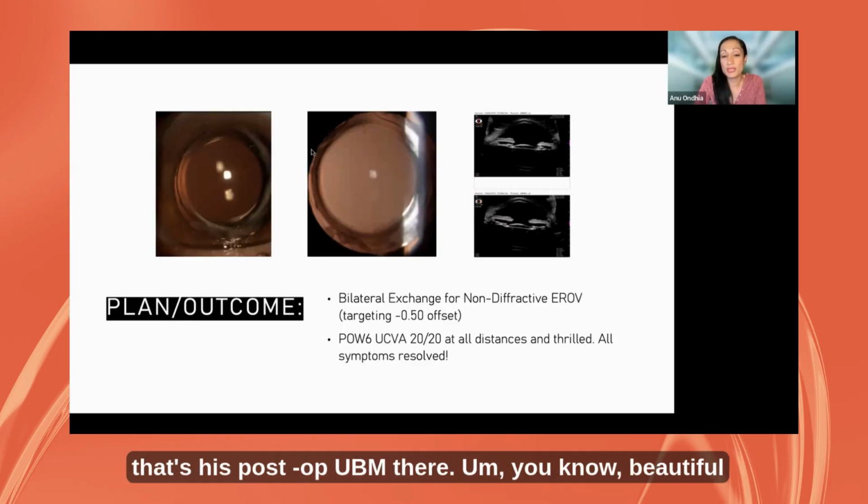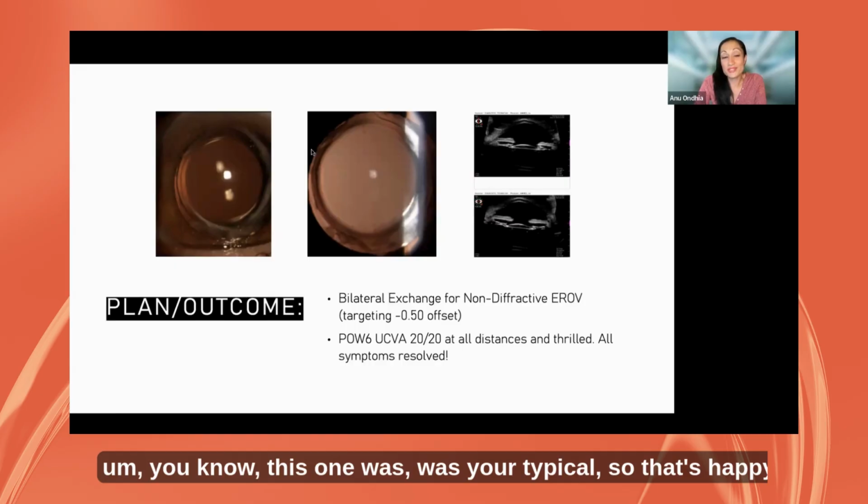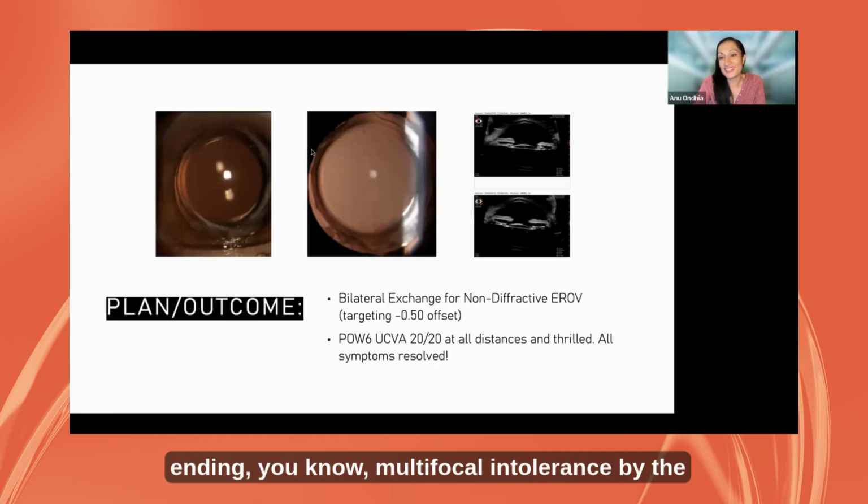So that's his post-op UBM there. Beautiful surgery, 6 weeks post-op. He's 20/20 at all distances and just super, super happy and over the moon. So this one was your typical happy ending, multifocal intolerance by the book.